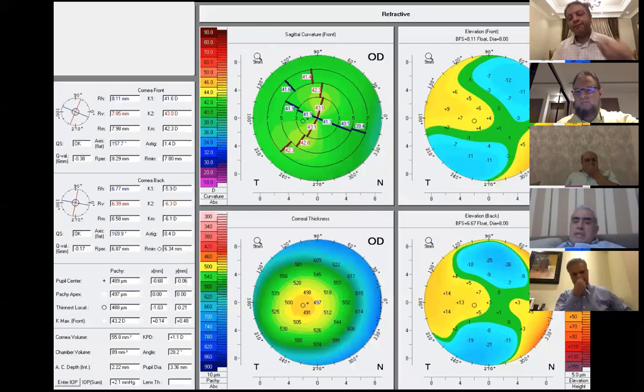But in the left eye, I'm very encouraged. Actually, in the right eye, I'm not sure, Dr. Mazen. It is a very difficult case to ablate. +6 diopters in the right eye, I don't feel comfortable doing +6 here. Dr. Yasser might have another opinion. Yes. So in this case, I will do LASIK. I will do femtoLASIK for this consideration.